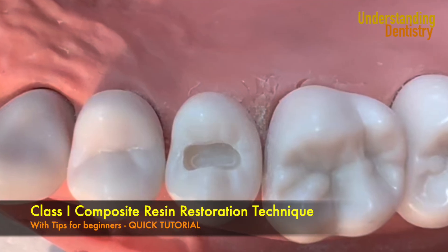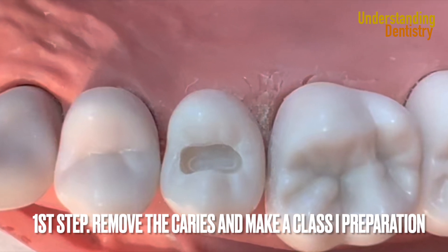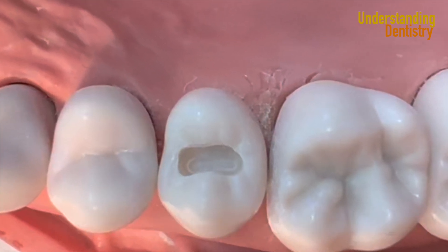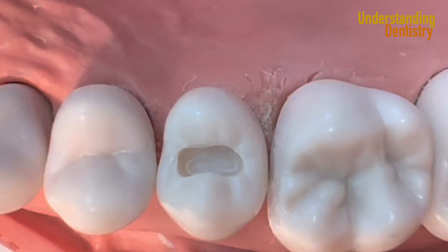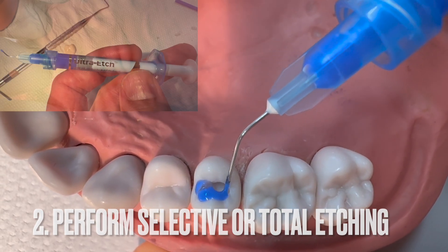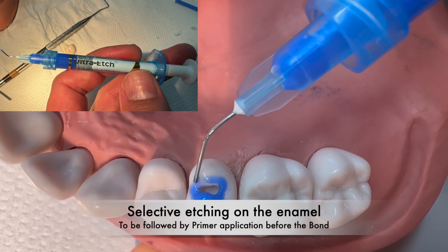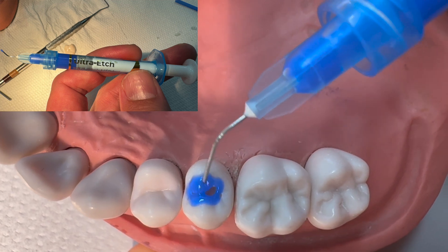Hello guys and welcome to this video to see details of every single step of Class I restorations. You removed the caries and did your preparation — there's a link for the preparation video. Now you have two options: either selective etching on the enamel, or the procedure we are going to do in this video, which is total etching.